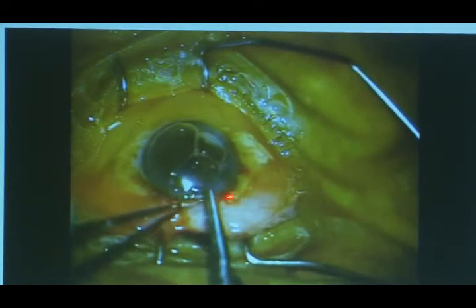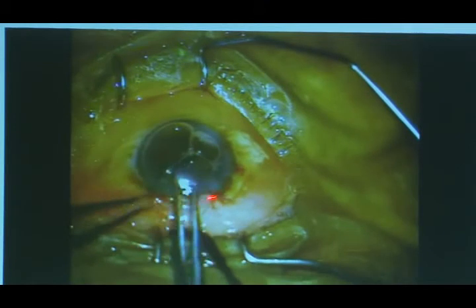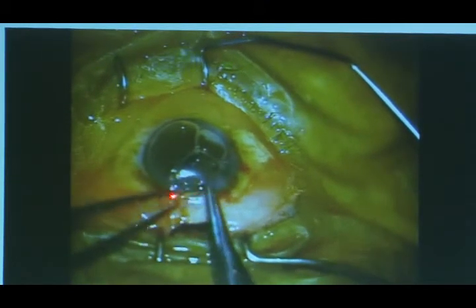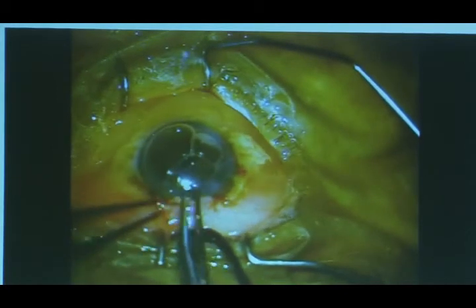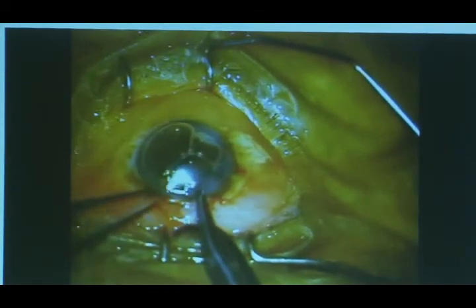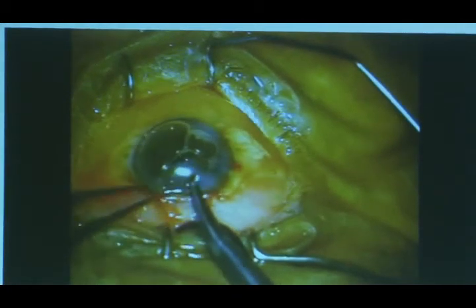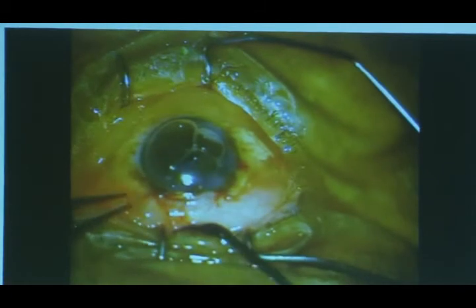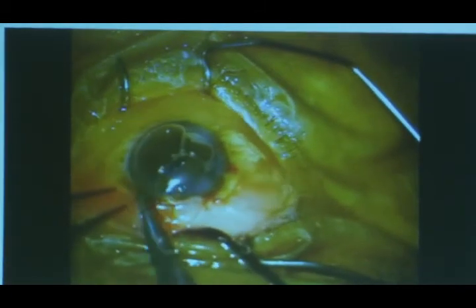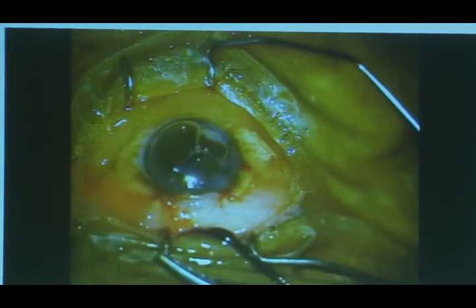So I put one box suture here. So in the middle here, there is this releasable suture. Here I put a box suture and then another box suture here. So that the entire cut edge of the conjunctiva is firmly opposed to the cornea and there is very minimal wound leakage from this spot post-operatively. So these are the steps that I follow for a routine phacotrabeculectomy.